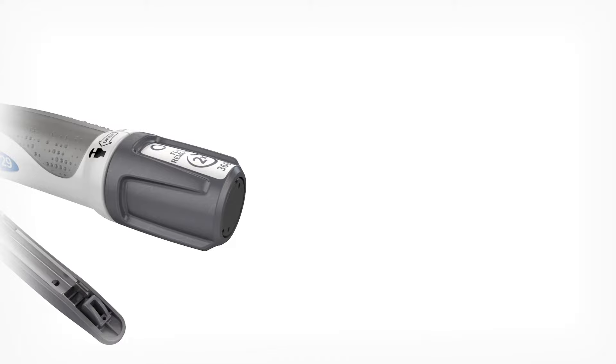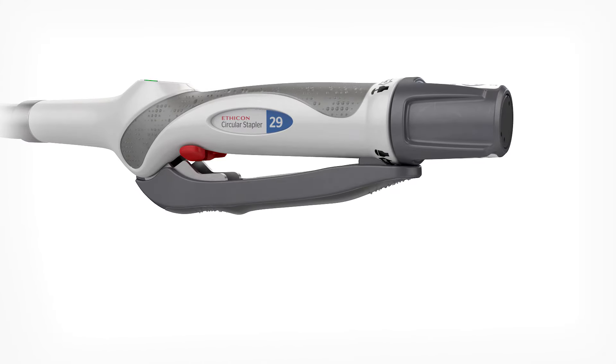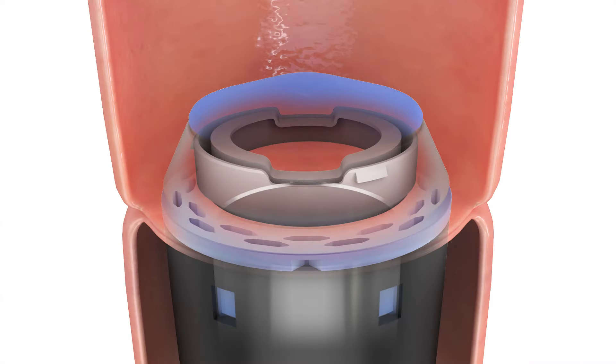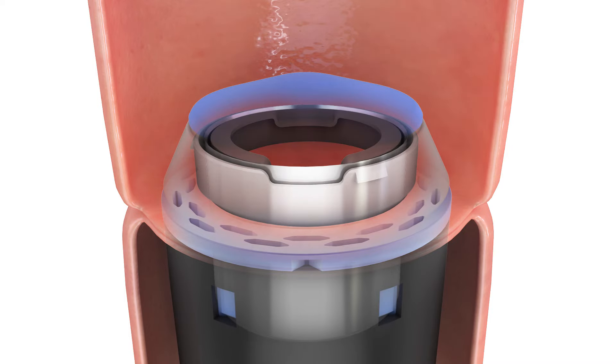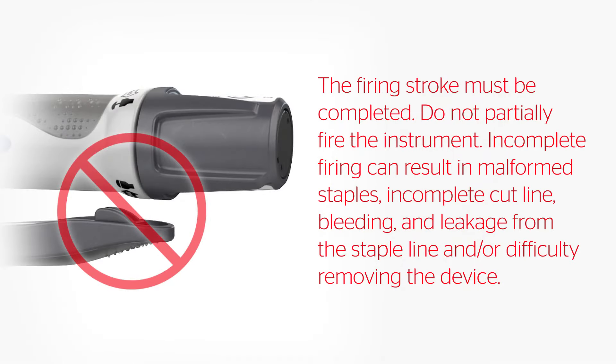When the safety has been released, squeeze the firing trigger with firm, steady pressure. Fire the instrument in one continuous stroke until the firing trigger touches the device body. You should notice both tactile and audible feedback during the firing sequence when cutting through the breakaway washer. The firing stroke must be completed. Do not partially fire the instrument.